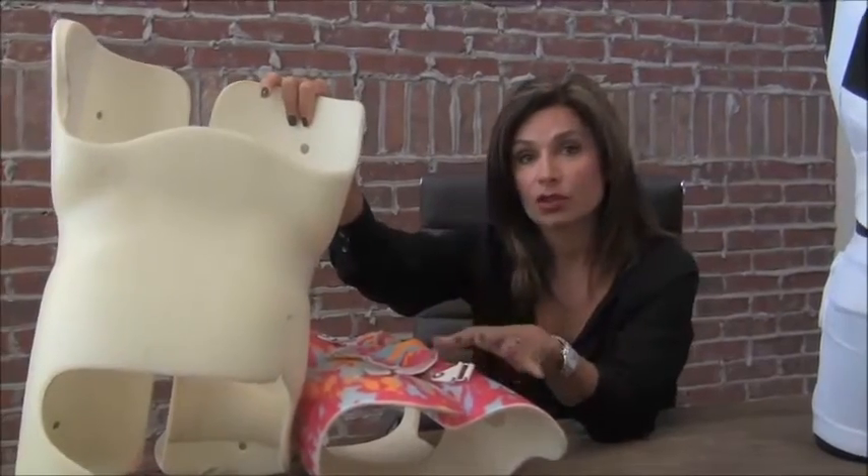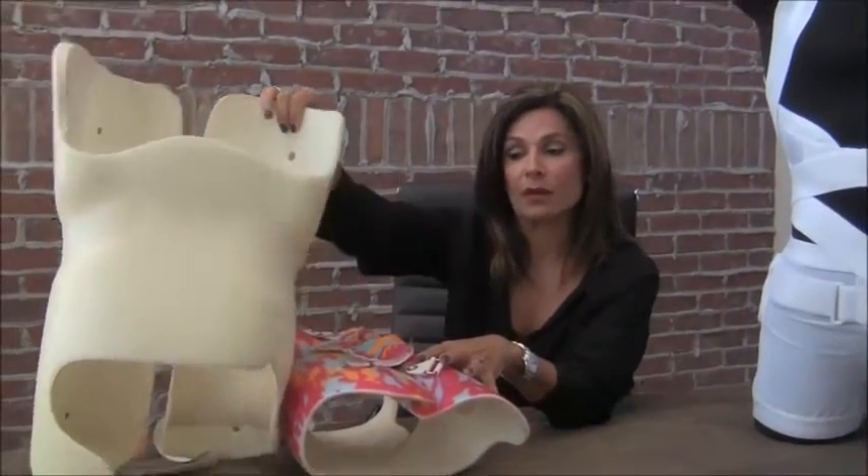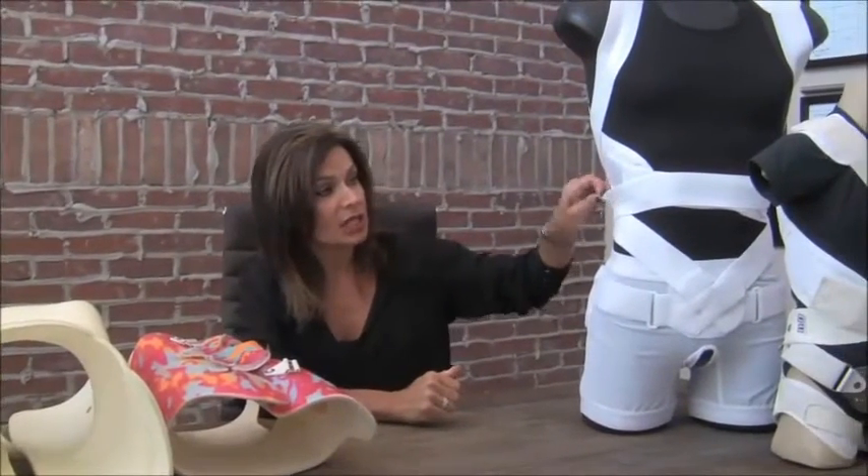But there is another solution that we have — a flexible brace called the Spine Core brace. As you can see, these bands allow full ranges of motion. Kids can participate in all sports and all recreational activities. The brace fits close to the body and can easily be worn underneath regular clothing, and when it is, it's virtually invisible.